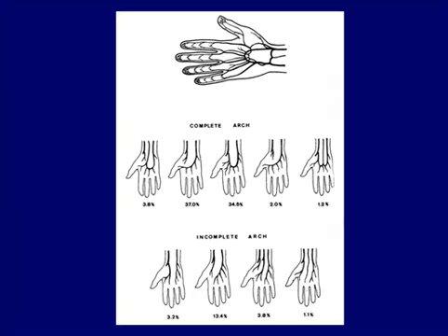Why we look at the radial artery and the ulnar artery is we want some sort of assessment of really what's going on to the perfusion to the hand, because we want to make sure that if we take that radial artery out, number one, it's a good conduit to use, but number two, that the digital perfusion will be maintained, because not everyone has a complete palmar arch.